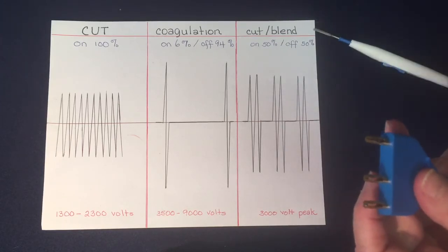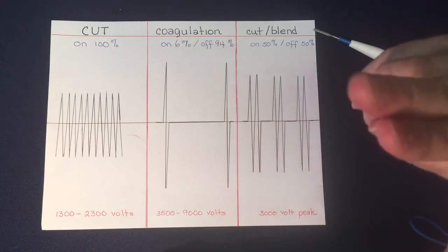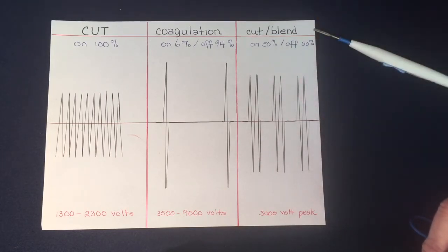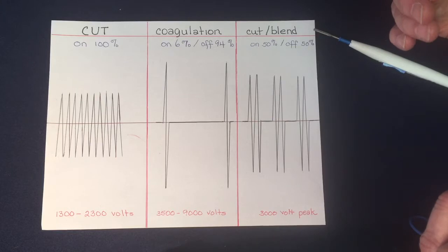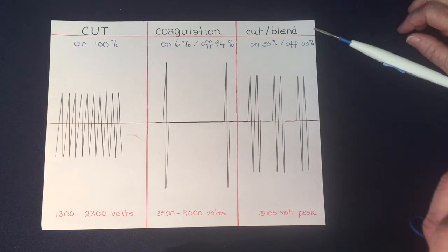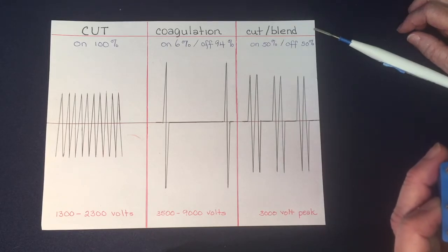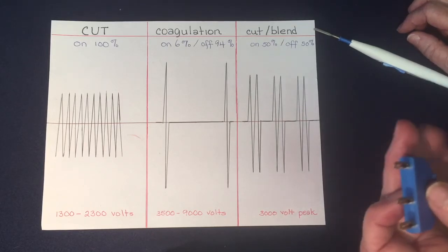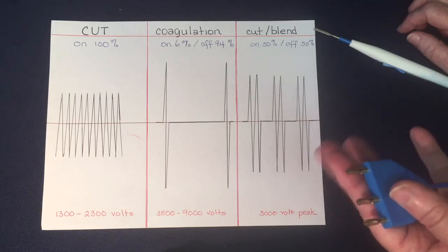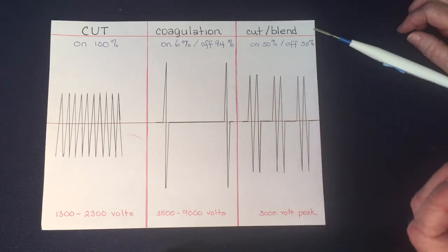What I have found is these prongs have a slit down the middle of it. Now if he's burning something inside the abdomen or inside laparoscopically anywhere and I'm controlling the bovie, then I want to be sure that I'm watching the monitor when I am pushing the bovie or when I'm activating it, so that I can see and make sure that I'm turning it on at the appropriate time and turning it off when it needs to be off.